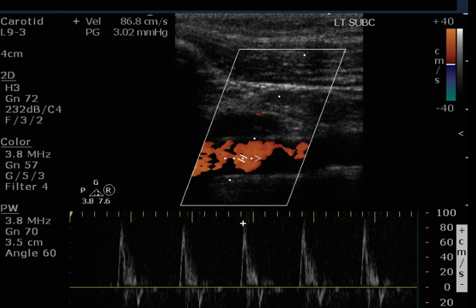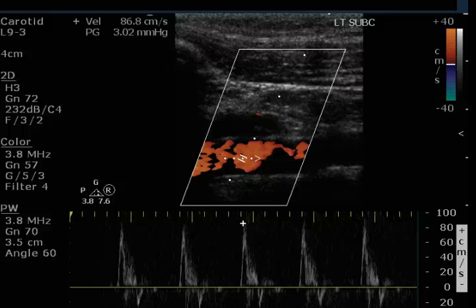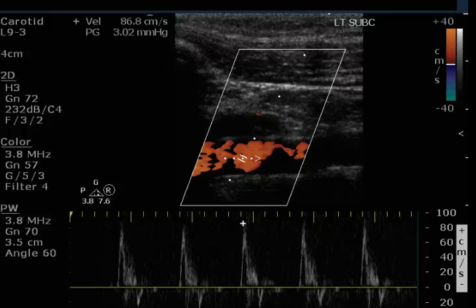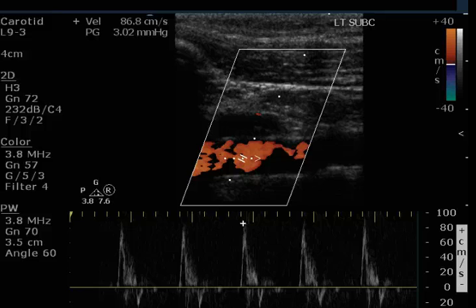So this patient does indeed have a right proximal ICA dissection. This dissection has not obstructed or affected the flow within the ICA. The sonographer demonstrated very well the presence of the intimal flap, the high resistance flow in the false lumen, and the lower resistance flow in the true lumen of the vessel.